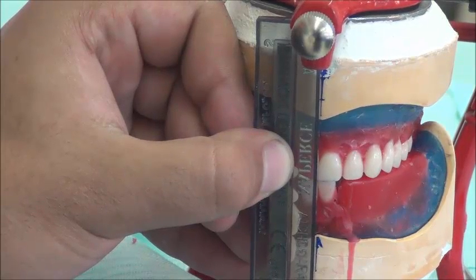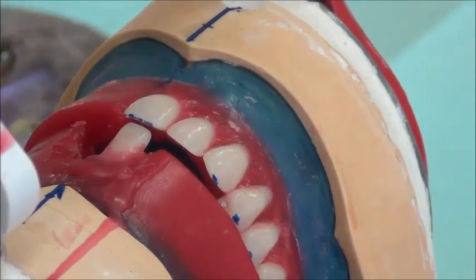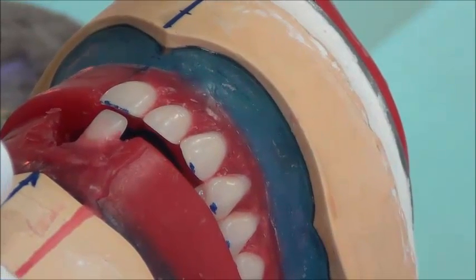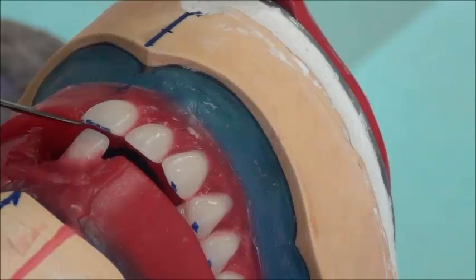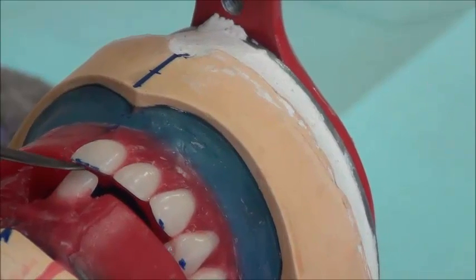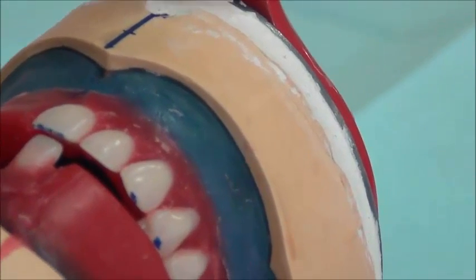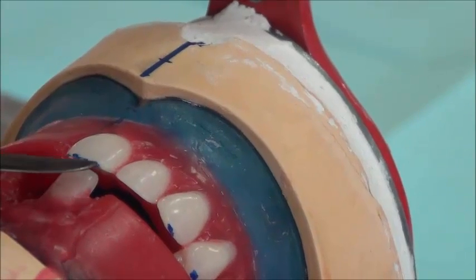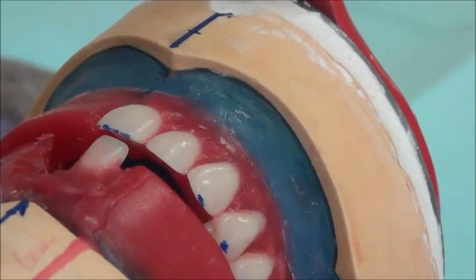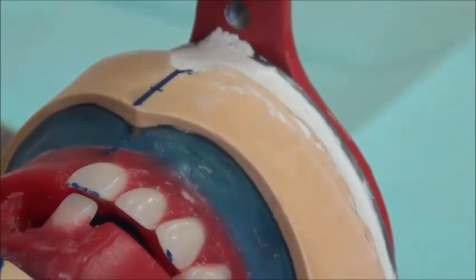Looking closely at the overjet and overbite: the overjet means the incisal edge of the lower is positioned further back than the upper incisal edge. The overbite means the lower incisal edge is higher than the upper incisal edge and goes to the inside — but this does not mean they touch. We have an overjet and an overbite with an empty space in between the two teeth, and this will be explained further in the lecture on anterior teeth setting rules.